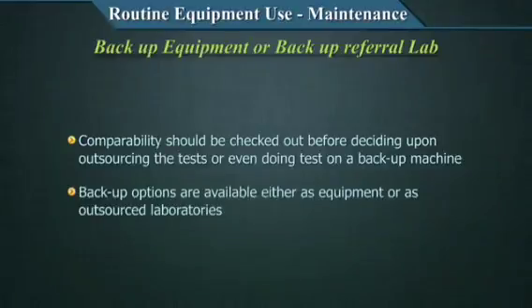You should also make sure that the backup equipment or the backup laboratory are doing well quality wise and their results are comparable to yours, so that the patient and the clinician are not confused by your not doing the test on your routine equipment.